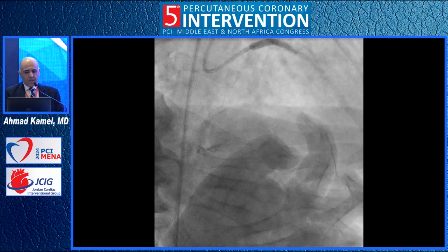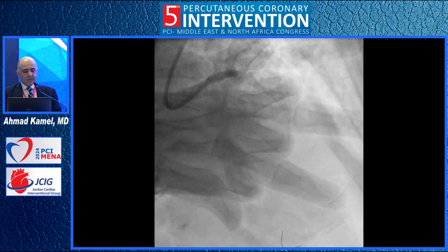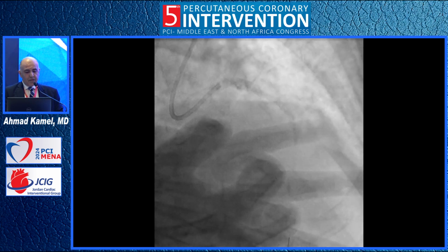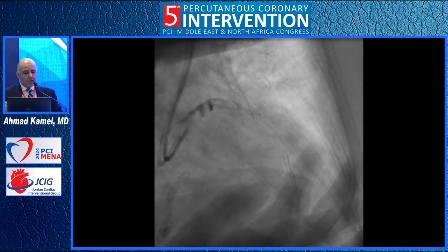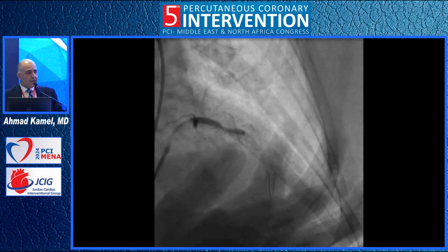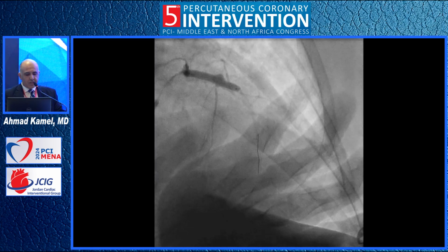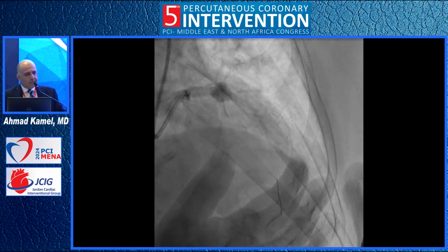This is on CPR, as you can see. This is compressions, still compressing, and this is after we stented, still compressing, and now we had some pulses. And as you can appreciate, distal to the stent we have a type 1 perforation in the LAD. So we have two complications, first dissection, and this type 1 perforation. So will you stop at this point, or would you proceed?